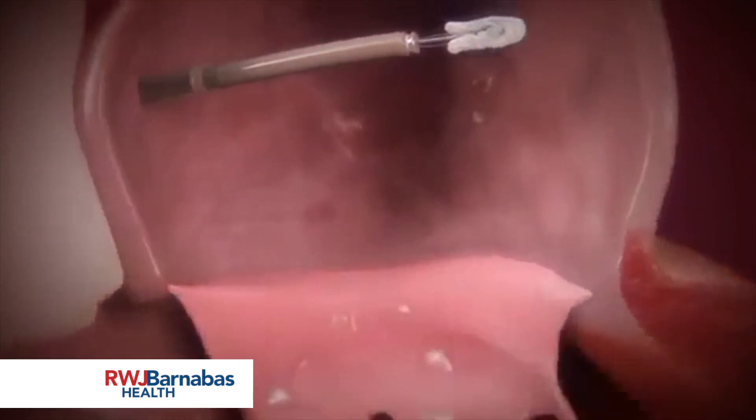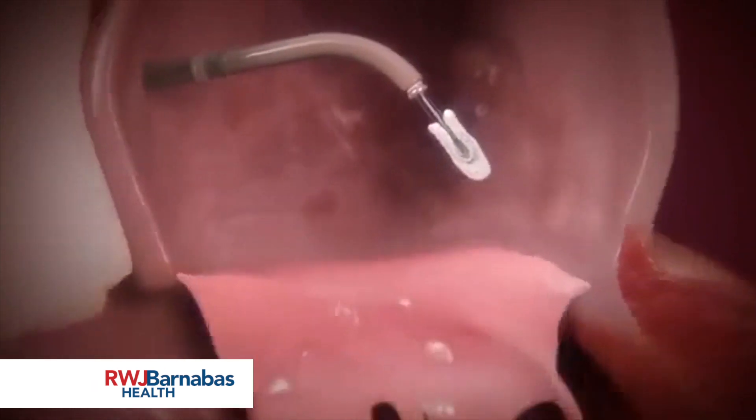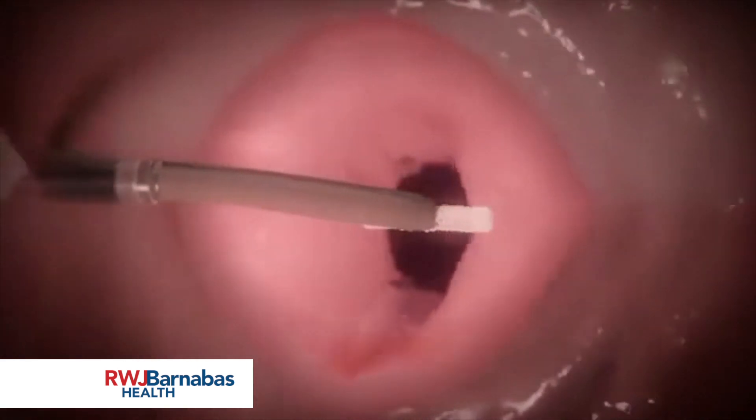The clip delivery system is advanced into the left atrium, positioning the clip above the regurgitation jet and perpendicular to the mitral valve plane. Inside the left atrium, the clip arms are opened to 180 degrees and positioned perpendicular to the line of coaptation before crossing into the left ventricle.